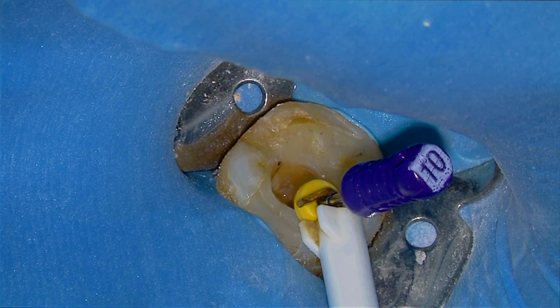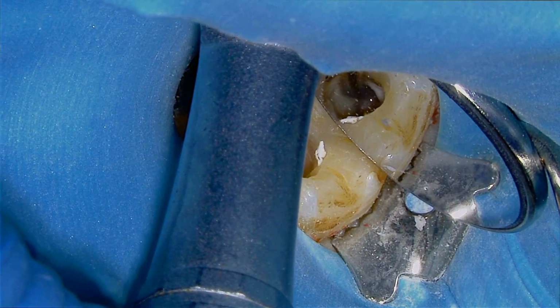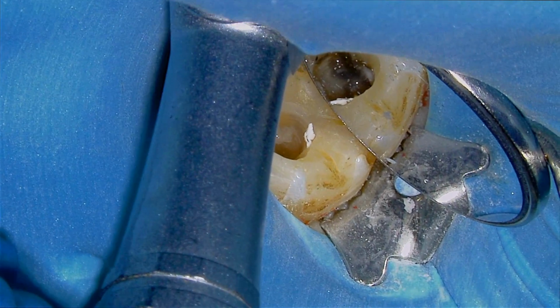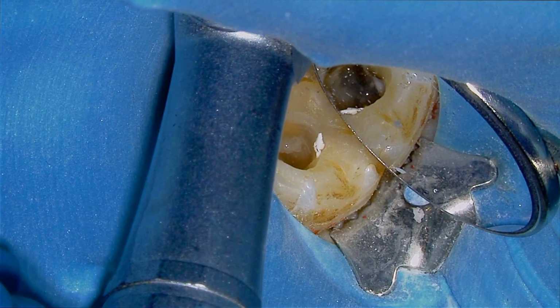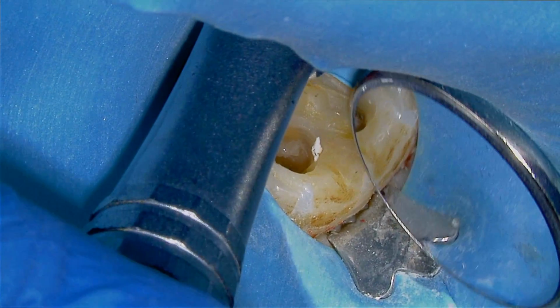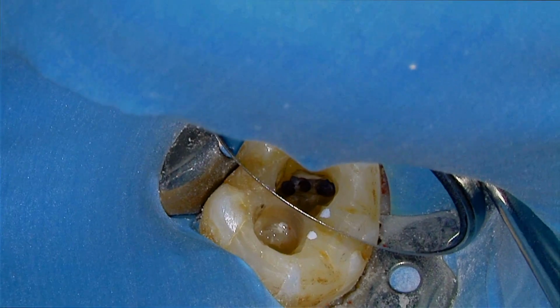Fortunately, I was able to achieve patency again in this canal, even though I was using BC Sealer. I clean and shape the mesial buccal and mesial lingual canals like normal, and now I'm going to try to use that Wave 1 Gold to scout around and see if I can get a catch in that middle mesial. And sure enough, you can start to see debris come flying up to the surface, and that is an awesome feeling. So I'm going to clean and shape the coronal part of that orifice, that canal, to 16 millimeters, which is the cutting flutes, and we'll see what we got. And sure enough, booyah, there's our middle mesial canal.